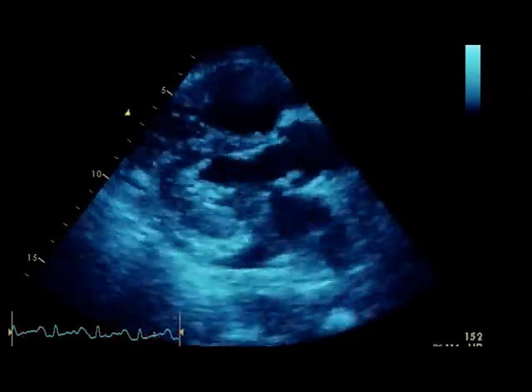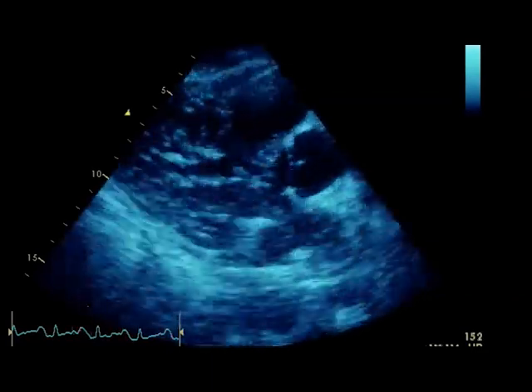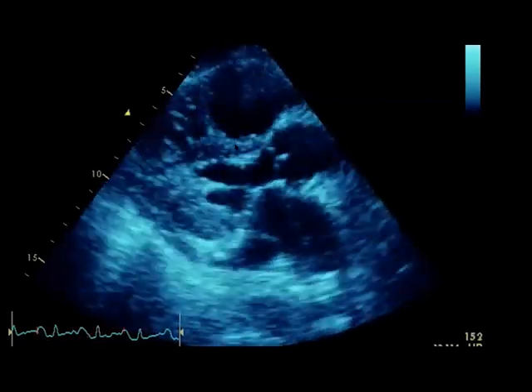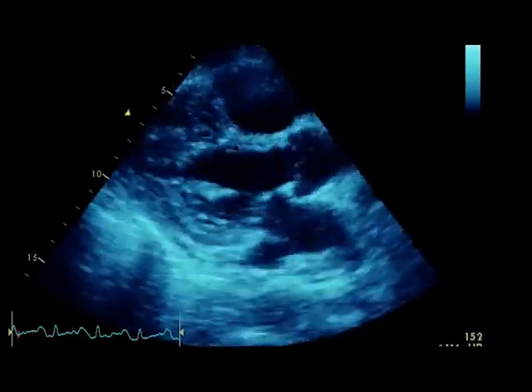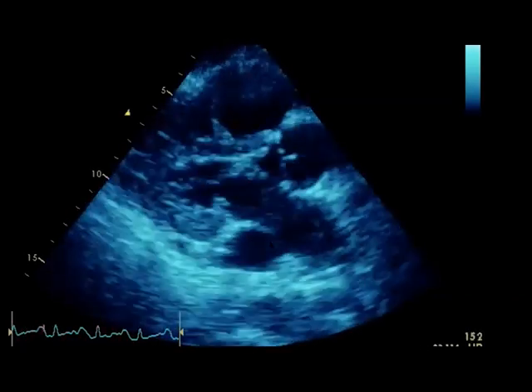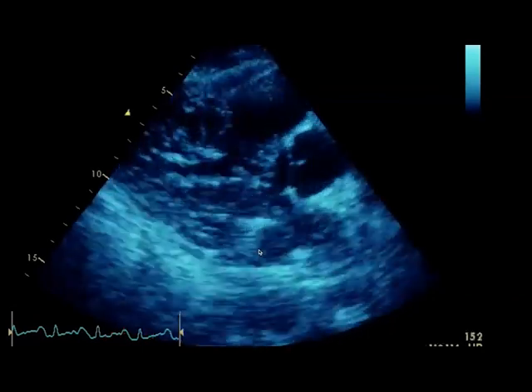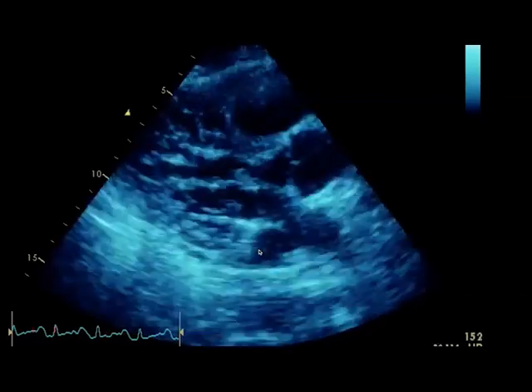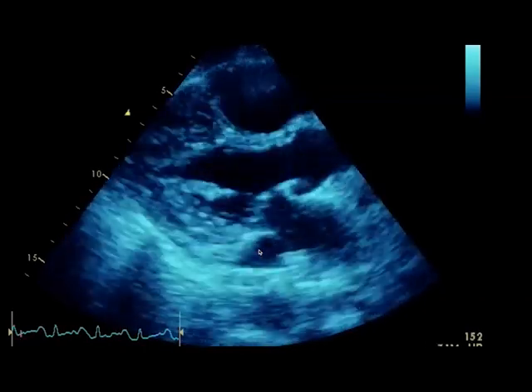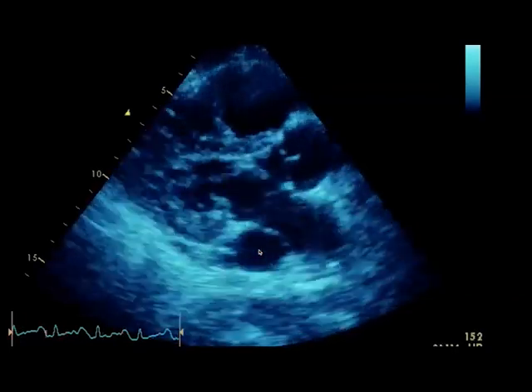There's a thickened RV free wall and a big RV that's larger than the aorta and left atrium — they should all be about the same size. The left ventricle is trying hard to compensate, hence the sinus tachycardia with rates up to 140. The interventricular septum is pushed over to the left — the D-shaped septum as expected in short axis. And down here, the coronary sinus is dilated, suggesting chronically elevated right atrial pressures — again pointing to chronically elevated right-sided pressures. So from the first view: the right heart is the problem causing all those biochemical abnormalities.